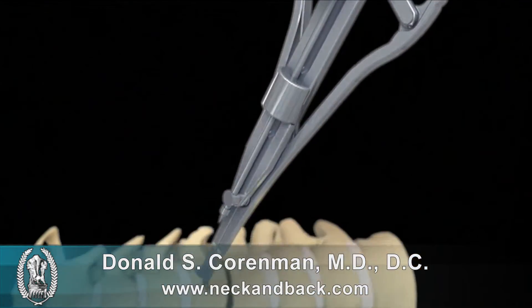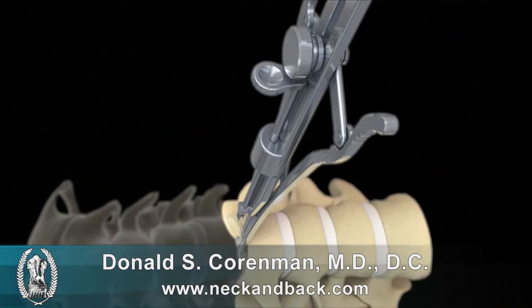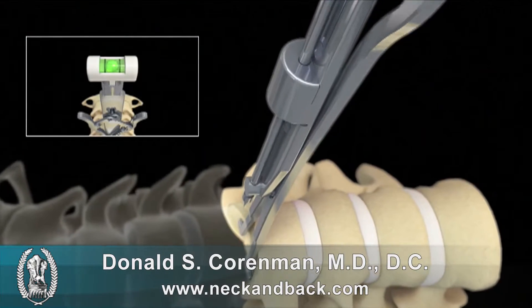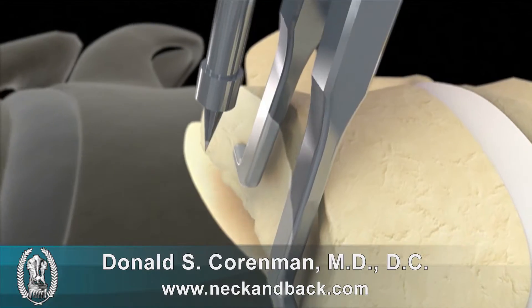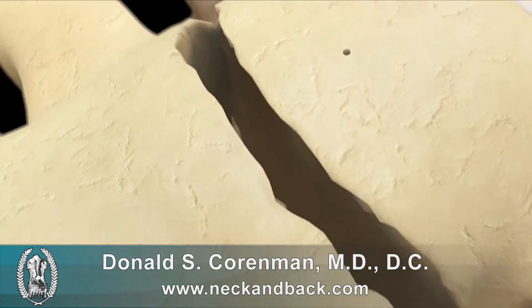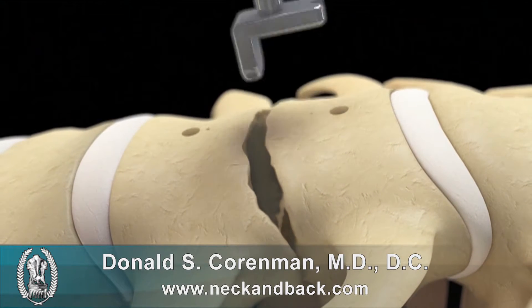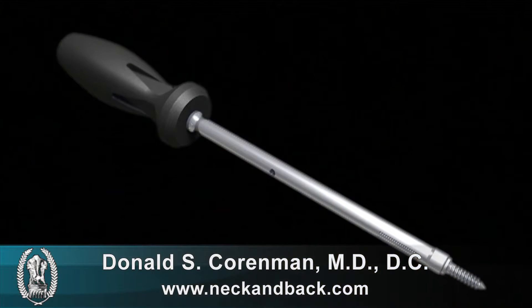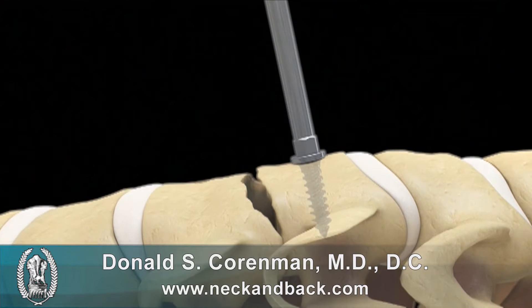At this point, you then have to find the perfect position for the two guide pins, which are essential to align the disc. This device is designed to help you find midline and to pick a specific point. You can see these small holes that are created in the vertebra, which are guide marks. You then create a drill hole for the guide pins that you're going to be placing. This is the guide pin itself that's inserted into the hole you've drilled.